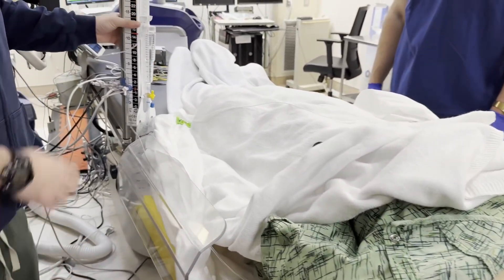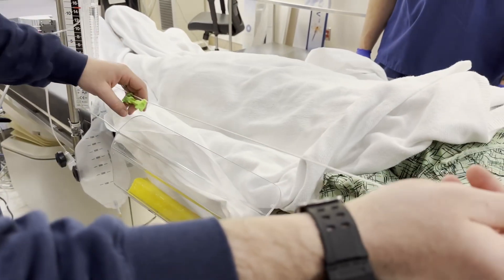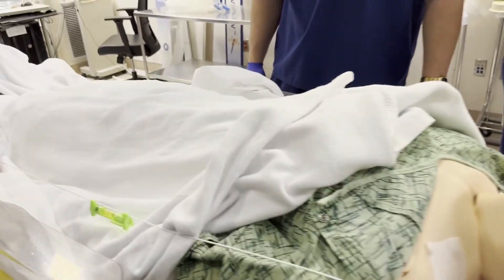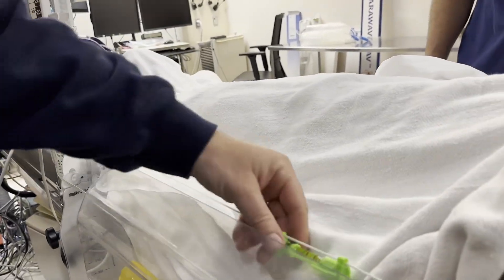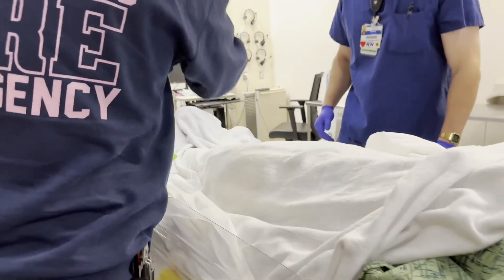Now we have to level it. We're going to take the string with the leveling device, put it to the tragus, and make sure it's leveled. You adjust it by either raising or lowering the drain. So now we're leveled.